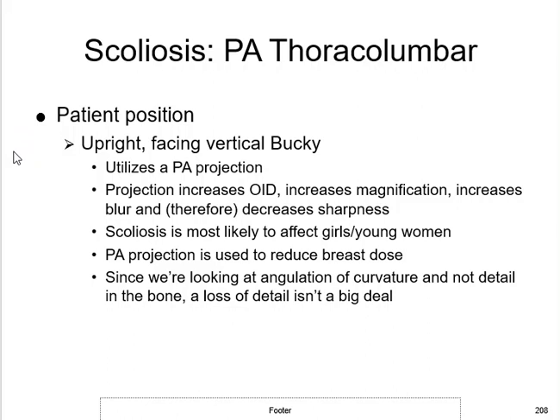aluminum, very thick aluminum. It's in kind of a wedge shape like that, and it's actually two of them. So you've got one with a big wedge that goes this way, and then one with a big wedge that goes this way, so that when you put those on the image receptor, that wedge shape is going across the image receptor or across the collimated field or somewhere before it strikes the patient.